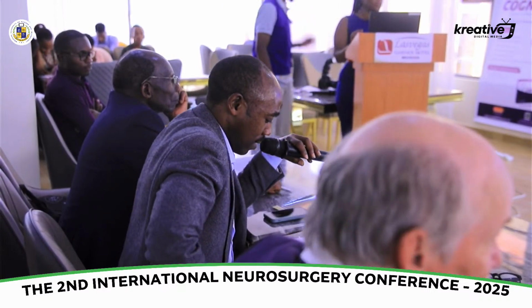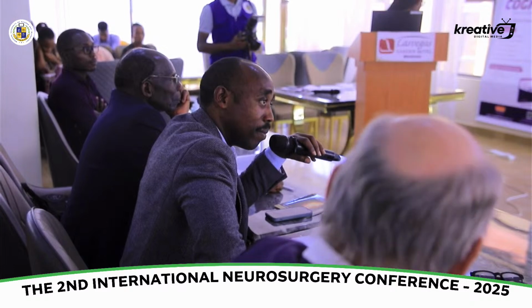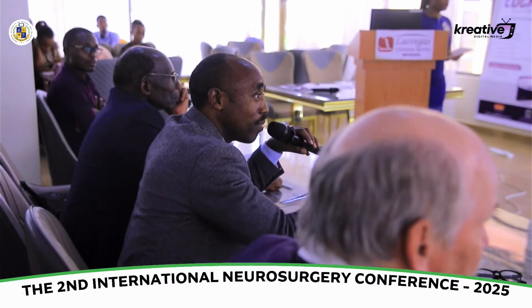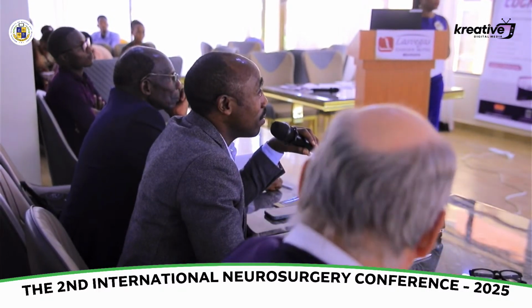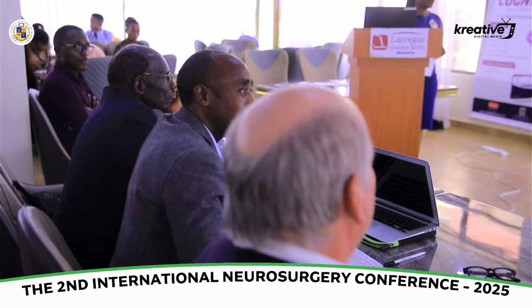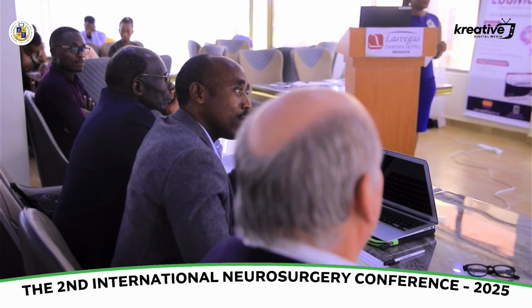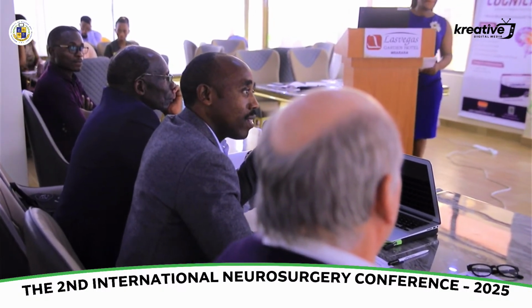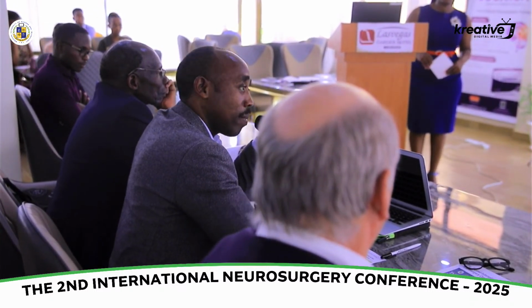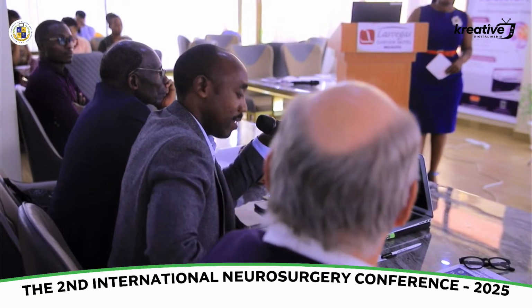Then the second one is basically the Spencer curve. This was the Spencer curve there: vessel diameter versus blood flow. I didn't quite get very well when that curve just tipped off. Maybe if we can show the slide a little bit more, I could better understand. And with the TCDs, for the purposes of the audience, as you're doing the TCDs, how will you identify a vessel, an artery or vein? We've noted already a positive coming towards you and negative going away from you. But how would you differentiate a vein and artery? Yeah, thank you.